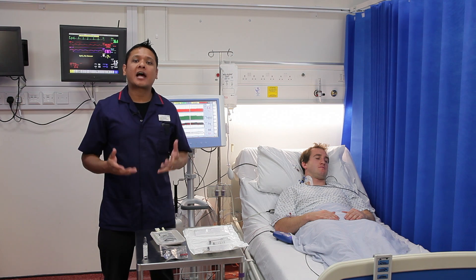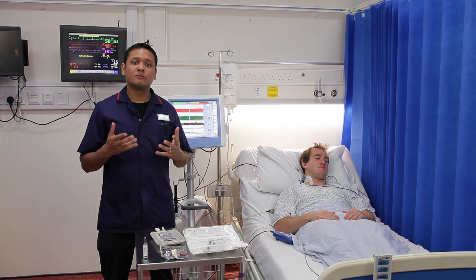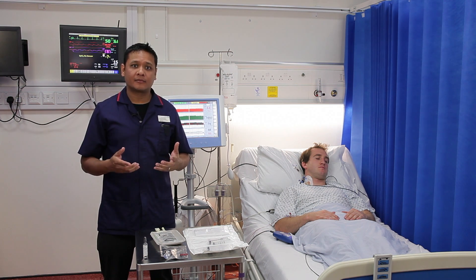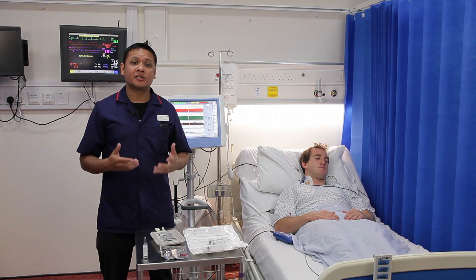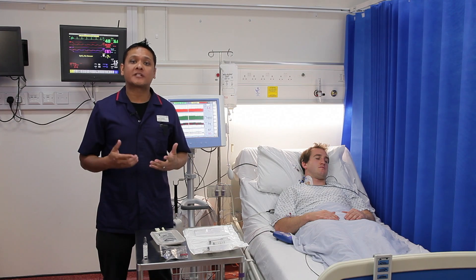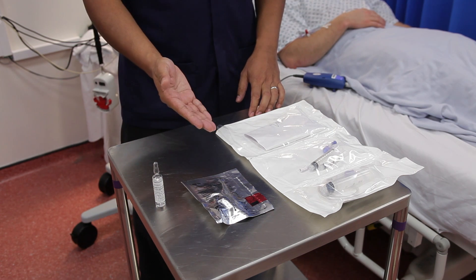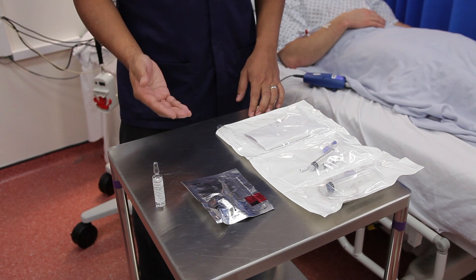The LitcoPlus Cardiac Output Monitor displays haemodynamic data to allow you to more effectively manage your patient in the intensive care unit. In this first video, I'm going to show you how to set up the disposables needed for the arterial part of the calibration technique. Make sure you have your lithium chloride ampoule, sensor and injector kit ready, and we'll start with the priming of the sensor.